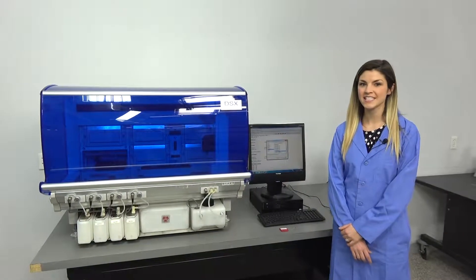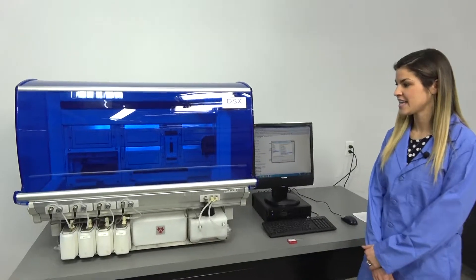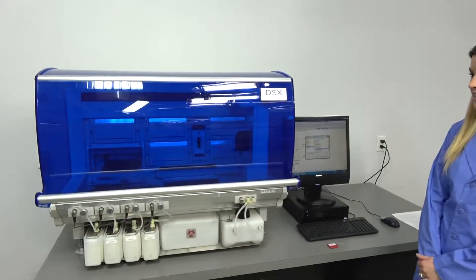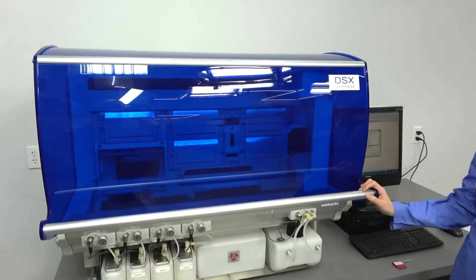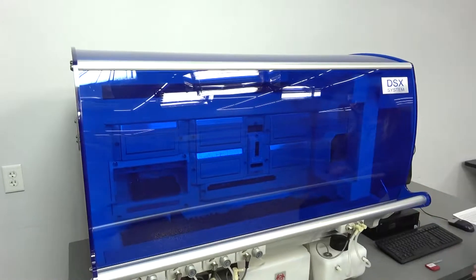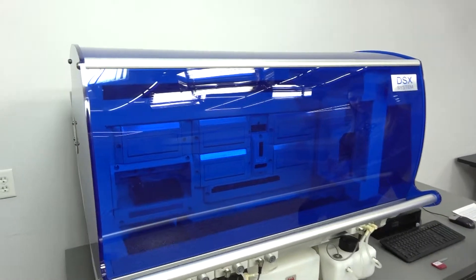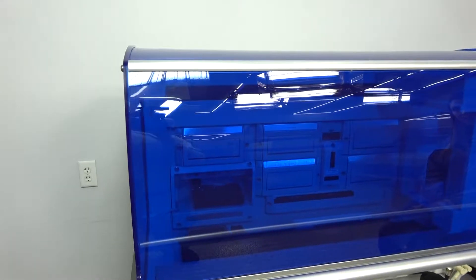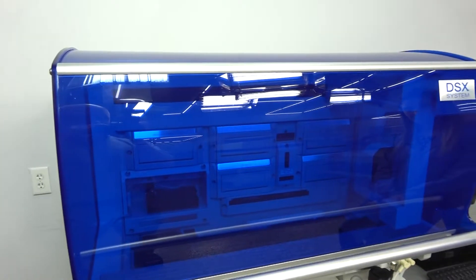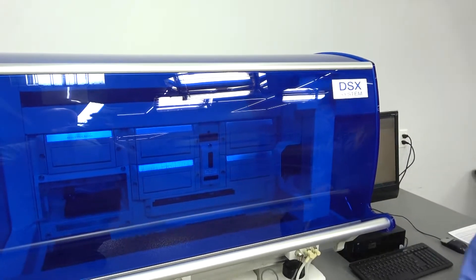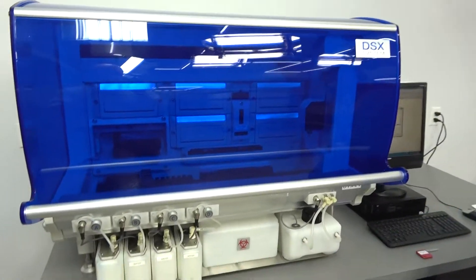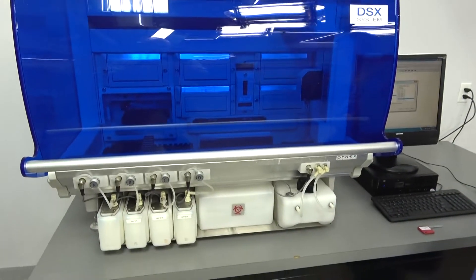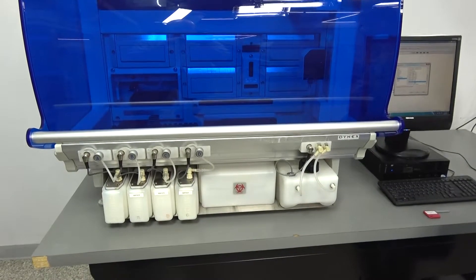This is a precise liquid handling system, and as you can see, the cosmetic condition of the outside is very pristine. There's no scuffs or marks on the cover, and all of the reagent bottles and waste bottles are in really good condition as well.